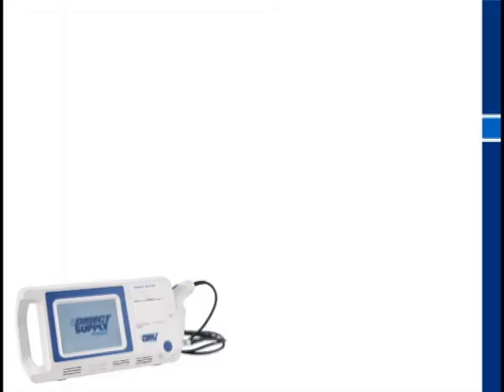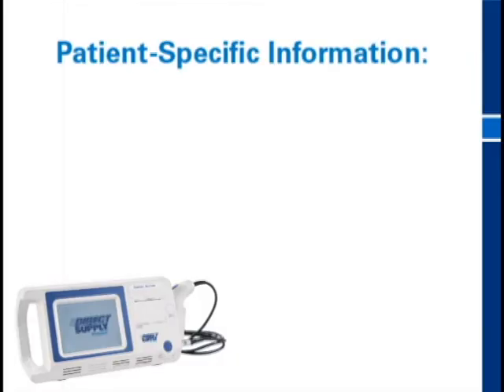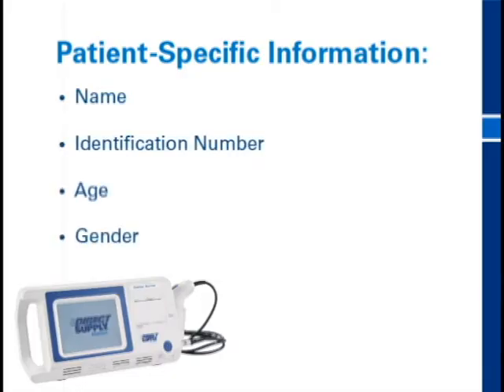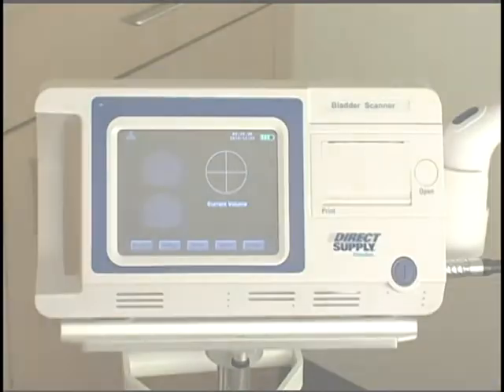The Attendant Bladder Scanner can store records of previous scans completed on a specific patient. You can save a patient's name, identification number, age, and gender. Up to 100 patient records can be saved.